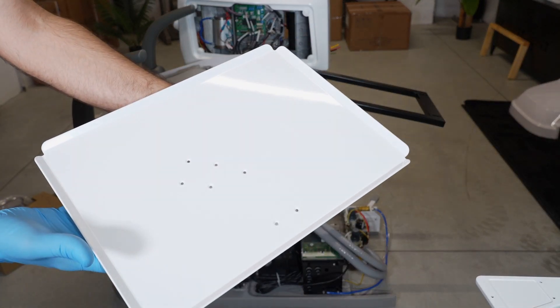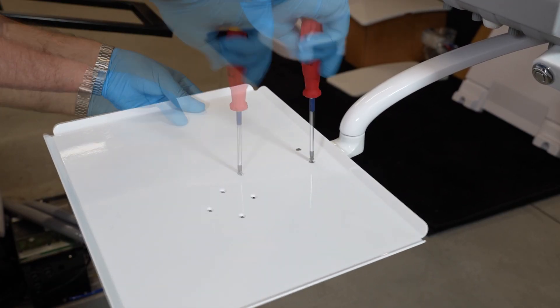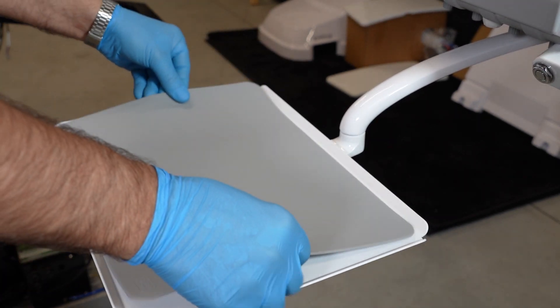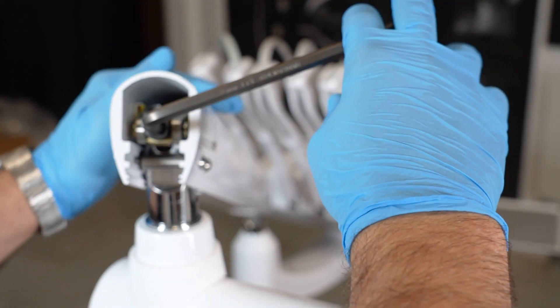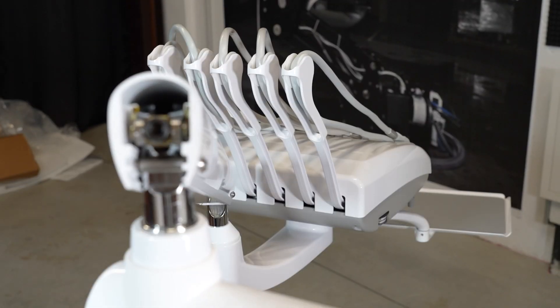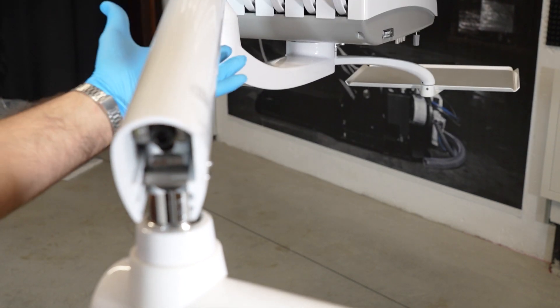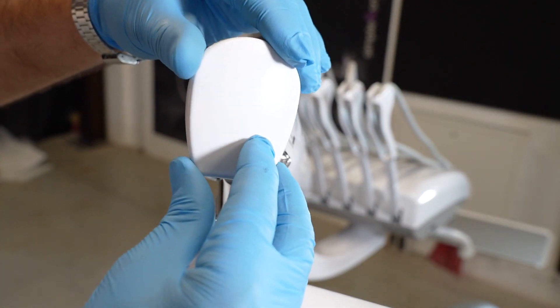Install the tray. Put its silicone on it. Regulate the second part of the arm to compensate for the weight of the doctor tray. Place the two caps on the arm.